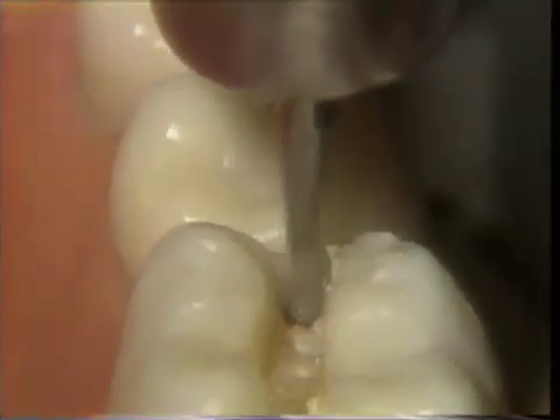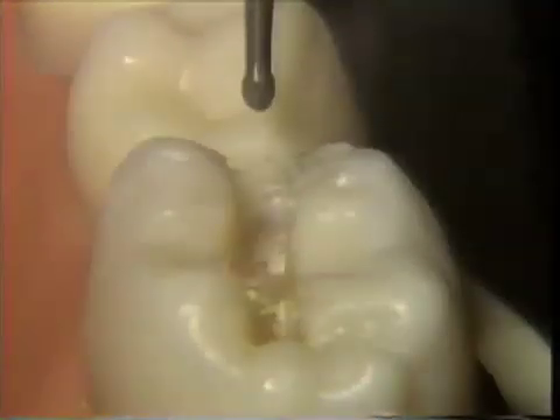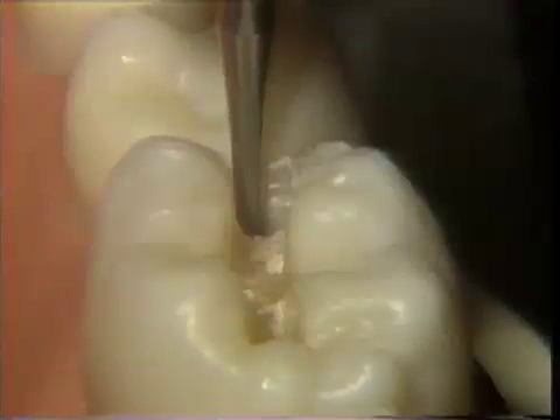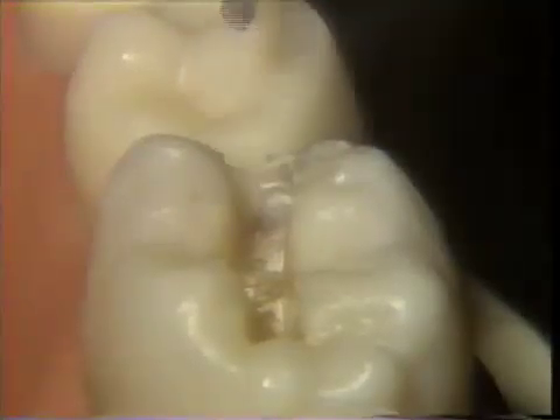To check the depth, the burr is withdrawn, the handpiece is stopped, and the burr placed into the prepared tooth. With the handpiece running at high speed, the burr is reseated into the point of initial penetration to the established depth, contacting this tissue without cutting. The burr is moved in a buccal direction until the desired extension is reached.